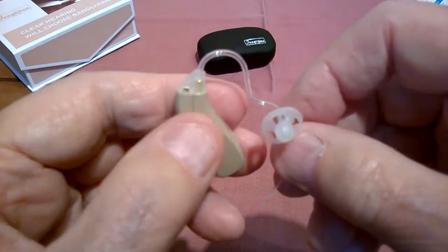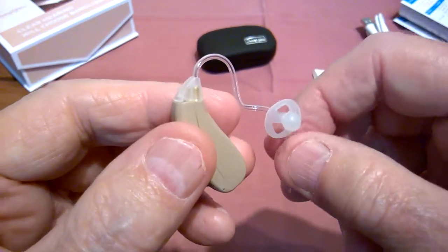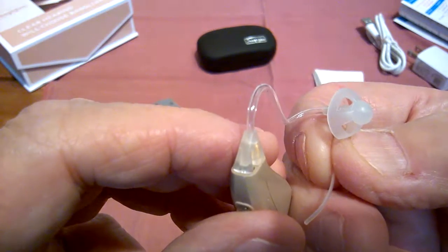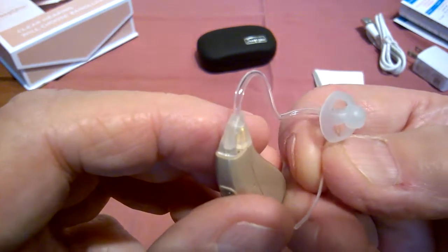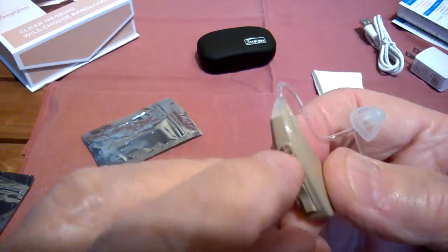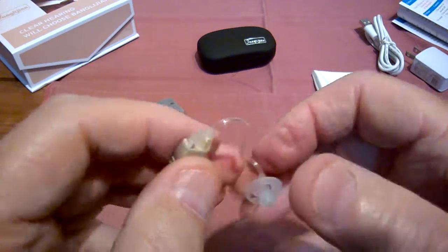Once this is in your ear canal, this will bend right under your earlobe and help hold the whole thing in place. So you probably want to leave that on, at least give it a try. And when you've done that, just simply turn them on and you're ready to go.